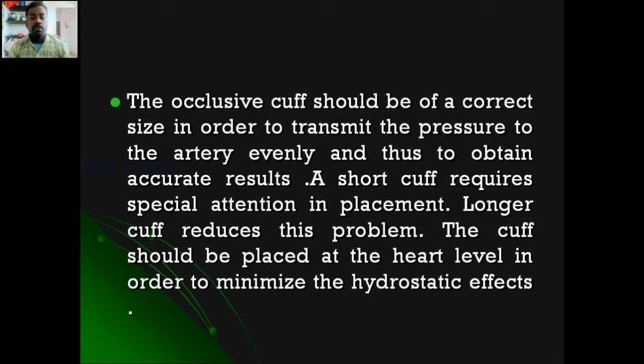A short cuff requires special attention in placement. A longer cuff reduces the problem. The cuff should be placed at heart level in order to minimize hydrostatic effects. Actually, our doctors measure blood pressure using the cuff and a mercury meter.